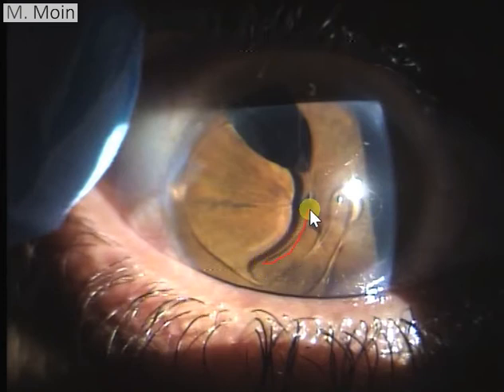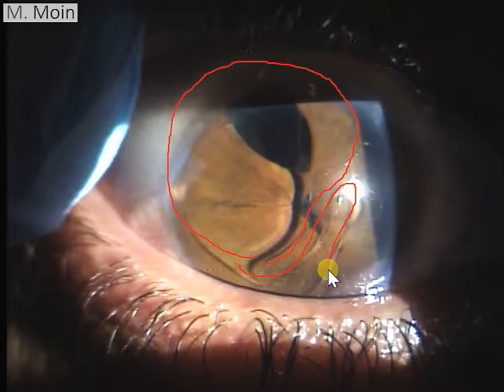And here you can see this is an intraocular lens. This is the optic of the IOL, and this is the haptic of the IOL. Interestingly, the IOL haptic is not C-shaped or J-shaped, but goes more in an S shape. So this is an anterior chamber intraocular lens which is lying in the anterior chamber, but the other thing is it is decentered superiorly and either temporal or nasally depending on which eye it is.